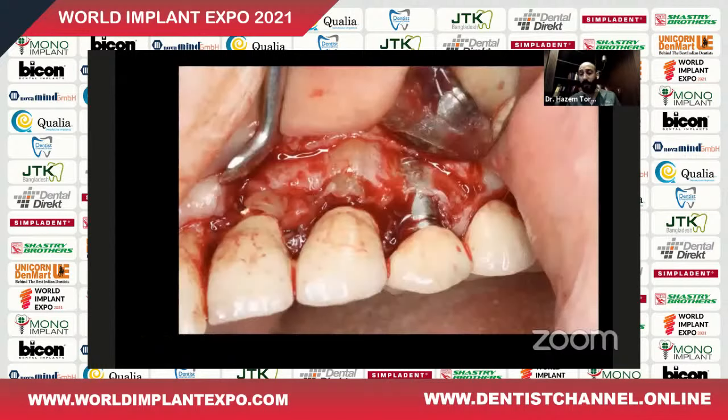And this is the critical period where you have to provide support at a stage where you have no buccal plate. You don't have the old buccal plate or the new one. In cases like this, there is a lack of providing the patient with what they need and what the situation needs, and of respecting the peri-implant tissues, where we have recession, collapse of the ridge, and lack of treatment planning in general.